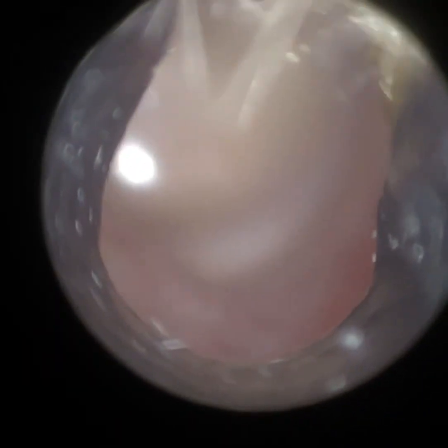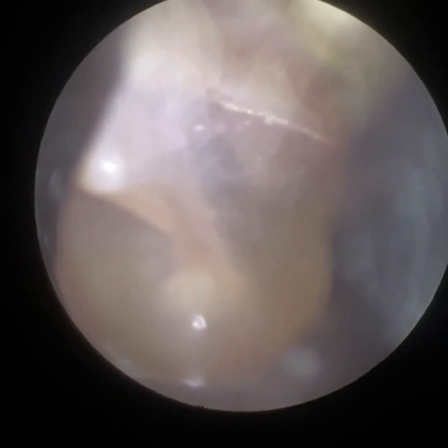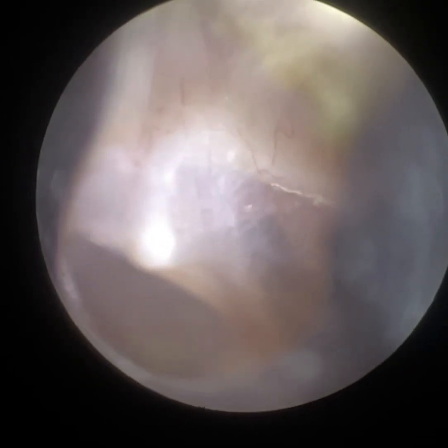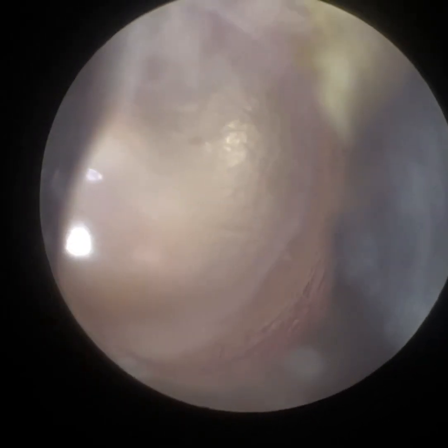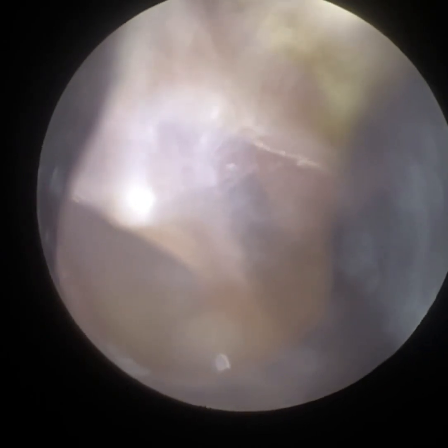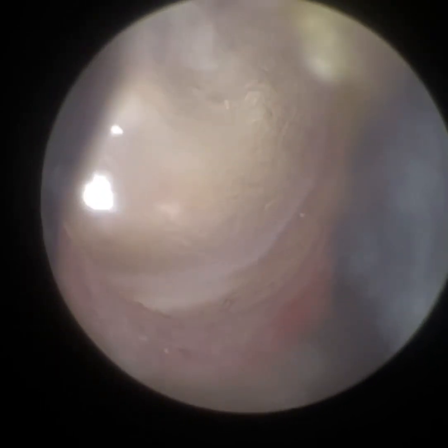It's come out in a large lump, and if you continue to watch until the end of the video, you'll have a still image of that. Just re-entering the patient's ear and I'm going to now adjust the focus to visualise the patient's ear drum. You can see how clear it is now just by adjusting the focus — that's one of the benefits of the Waxscope. To adjust the focus, it's a simple swipe on the app just with your finger, which makes it much more user-friendly.